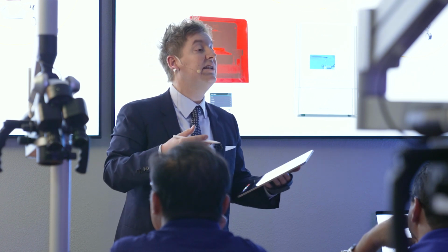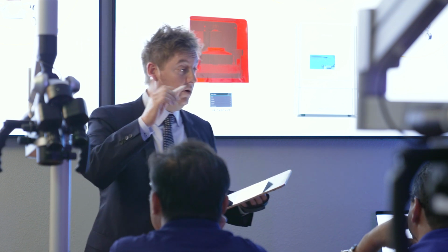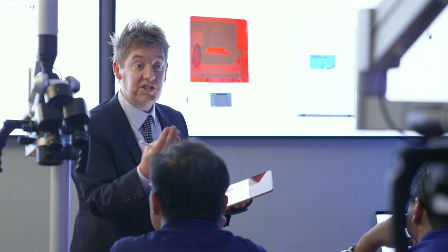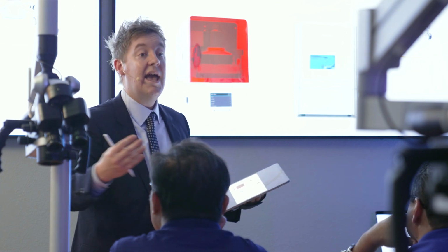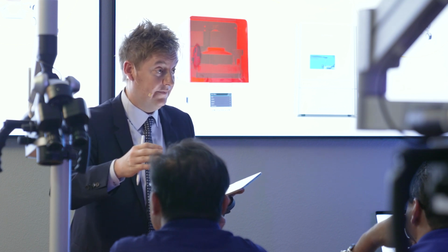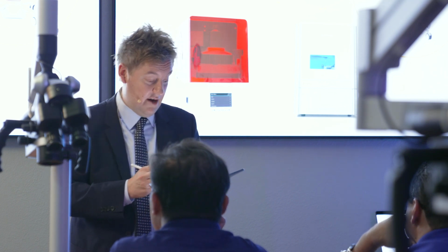What about Modjaw? Okay, I'm going to show you what we can do today in terms of what we refer to as the dental avatar, meaning that we can take multiple images, an intraoral scan, a cone beam, 4D jaw tracking, and a facial scan for soft tissue, and put them all together and make a 3-dimensional moving avatar with real teeth, real bone structure, and real jaw movement. It's absolutely incredible. It's super fun.